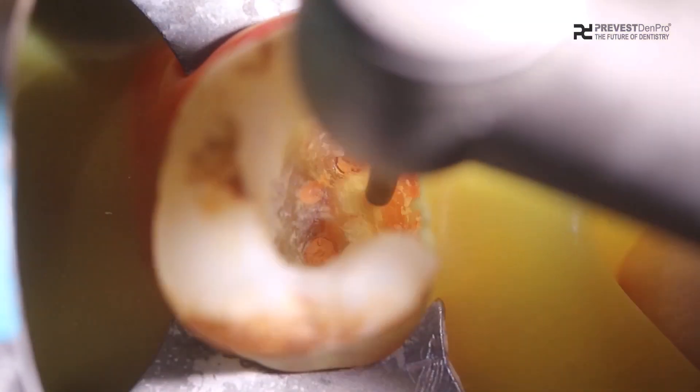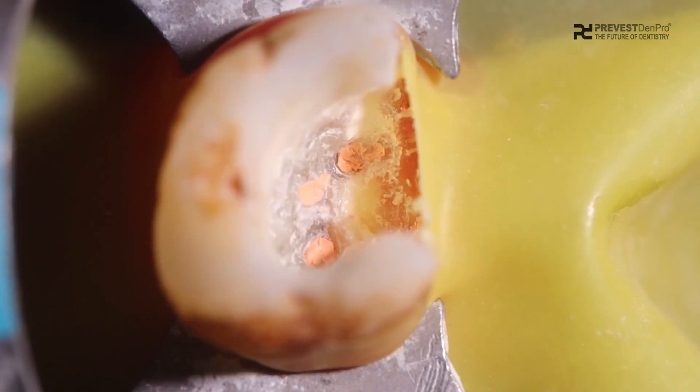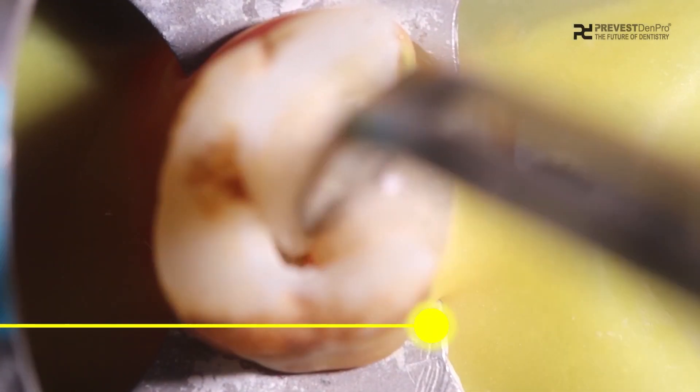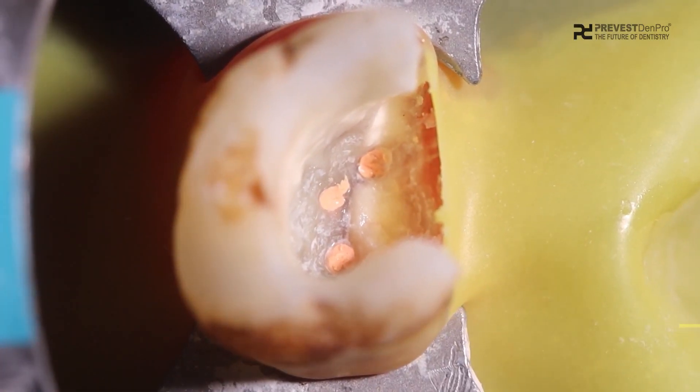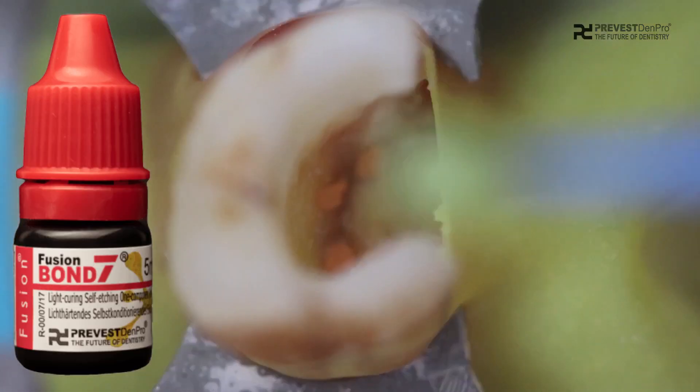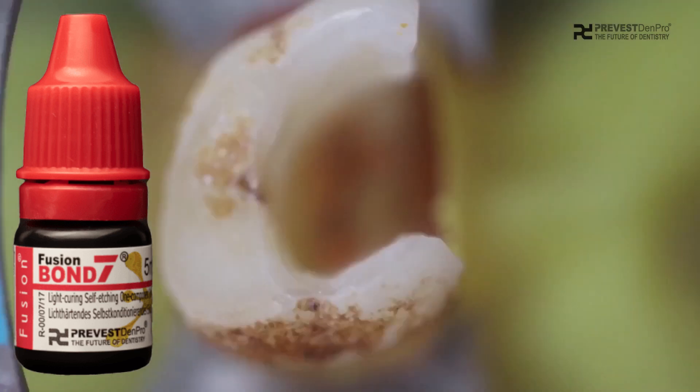After obturation with Serafil RCS and cleaning the cavity, we proceed with the post-obturation restoration with Fusion Bond 7, Fusion Flow, and Magma Entry. Fusion Bond 7 is a self-etching light-curing bonding adhesive.